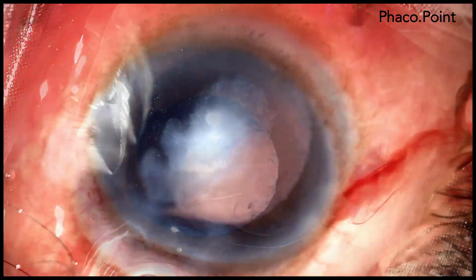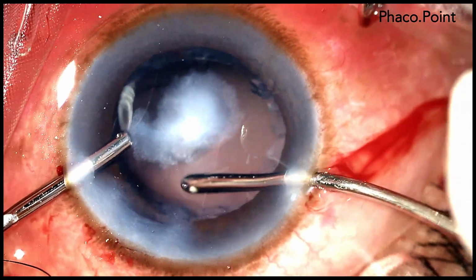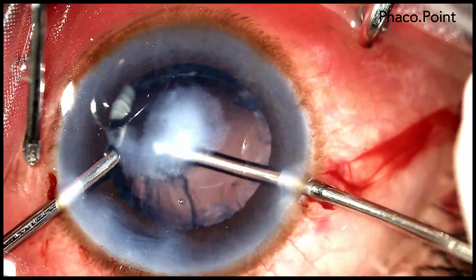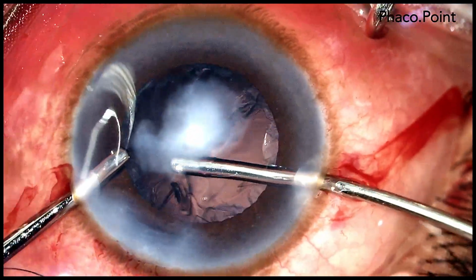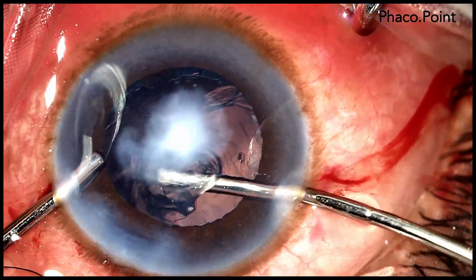You will notice that once you have removed the epinucleus and the nucleus, we have so much more visibility because of the advantage afforded by the red glow. Next, we proceed with a bimanual irrigation aspiration.